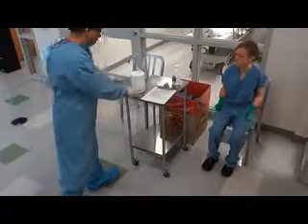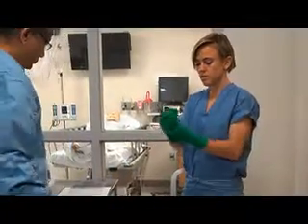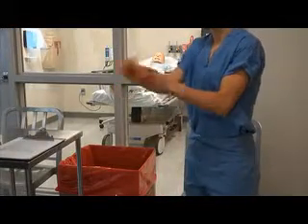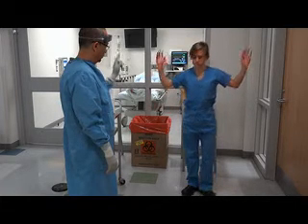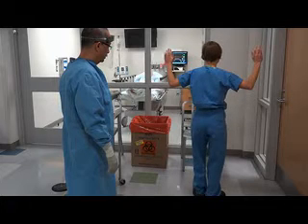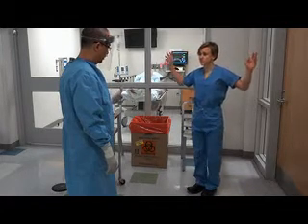Sit down on the designated clean chair and use disinfectant wipes to clean all external surfaces of your shoes. Disinfect your gloves. Remove the last set of gloves as described previously. Disinfect your hands with an alcohol-based hand rub. The trained observer should conduct a final inspection at this point to identify any contamination of your surgical scrubs. If there is contamination, an occupational safety and health coordinator should be informed immediately before you exit the PPE removal area. The observer may now be contaminated and should perform the same PPE removal procedures as the healthcare worker before leaving the anteroom.